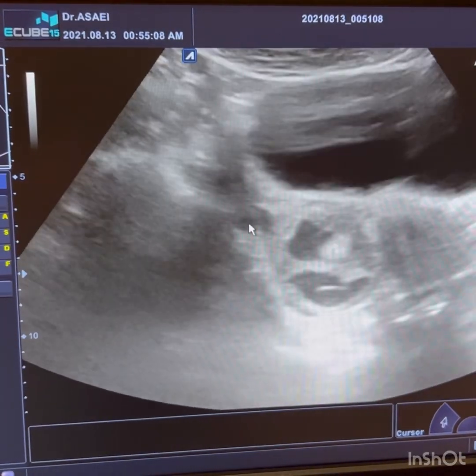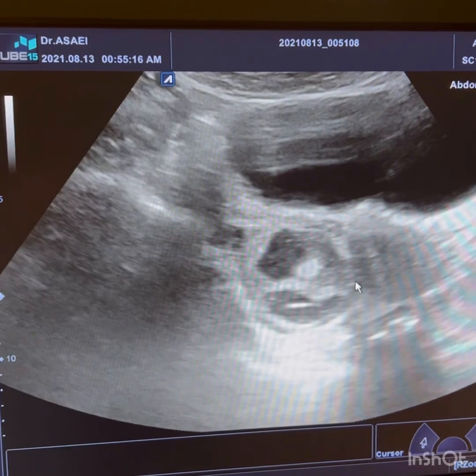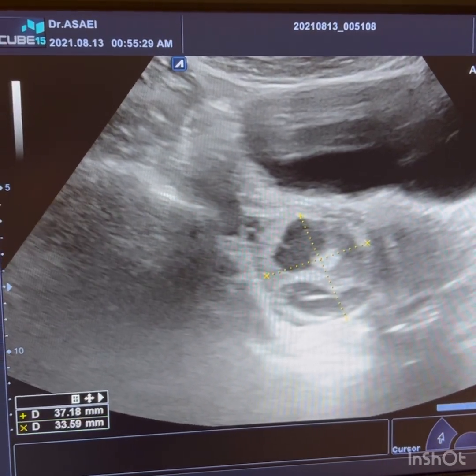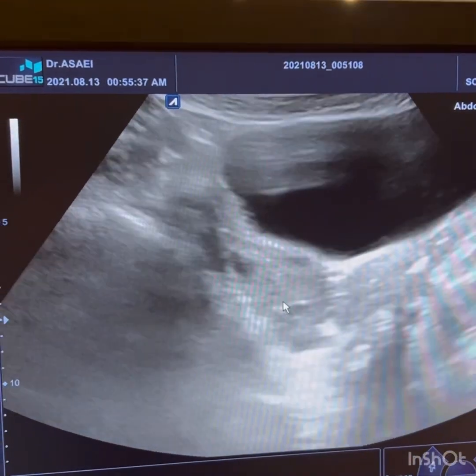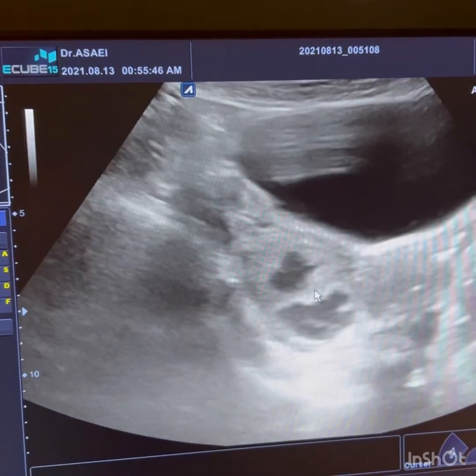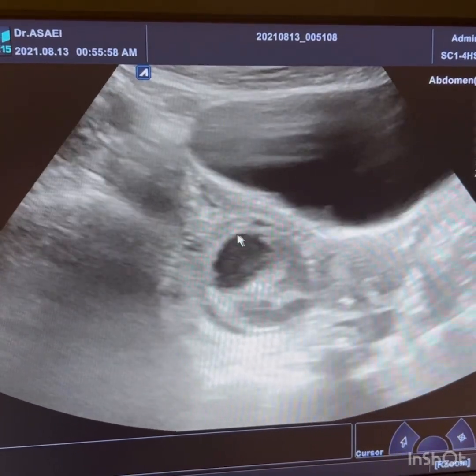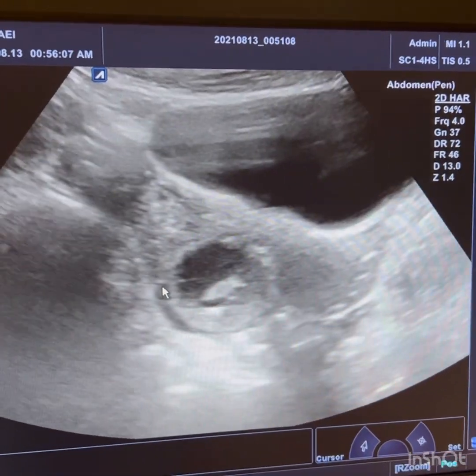In this patient, we also have a suspicious cystic structure in right ovary, showing suspicious criteria of malignancy which were explained earlier. It is about 4 centimeters, and the criteria suspicious for malignancy in this right ovary complex cyst are thick wall, mural nodules, and complex heterogeneous cystic solid appearance. So further workup with pelvic MRI and correlation with lab data for ruling out malignancy, and also follow-up with sonography in this patient is recommended.